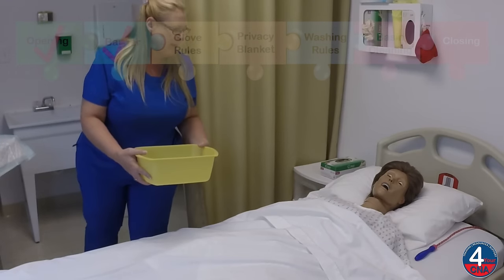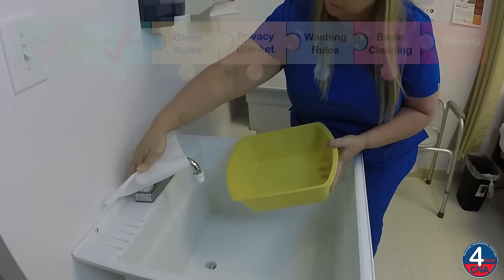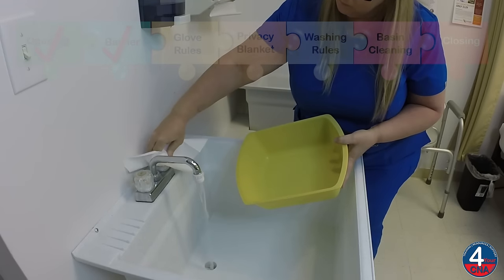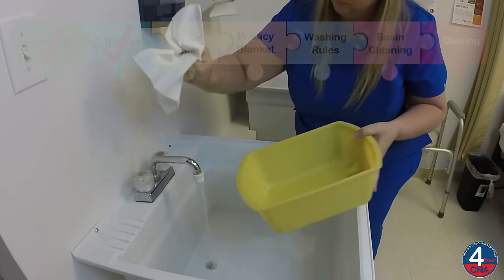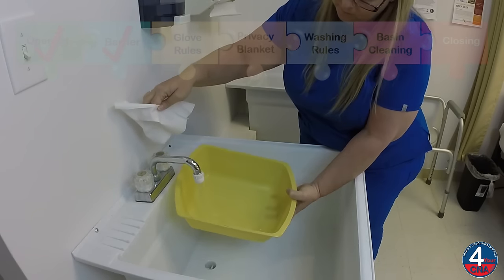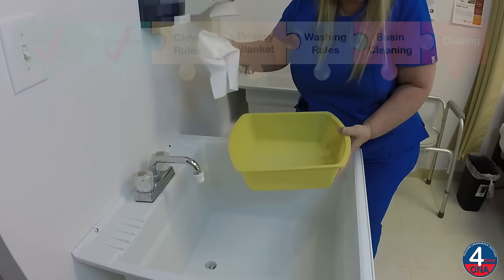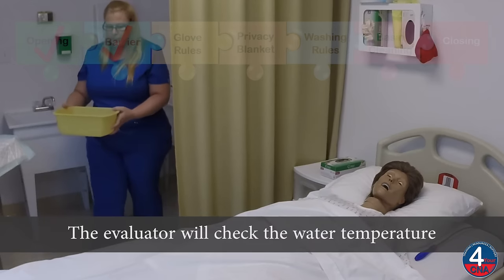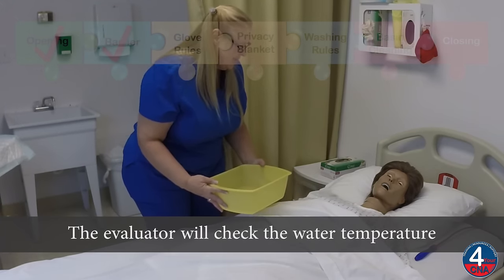All right, Ms. Jones, I'll just get some water. I'll be right back. Would you like to check the water temperature and make sure it's okay? It's good? Good.